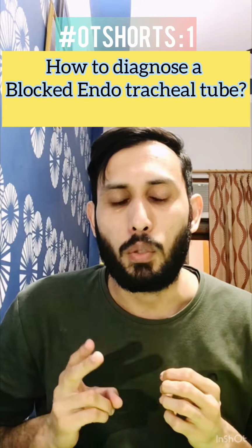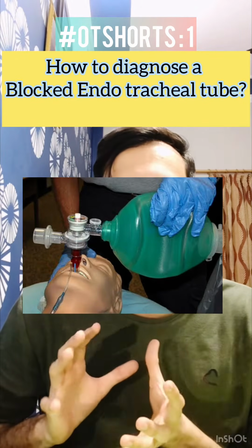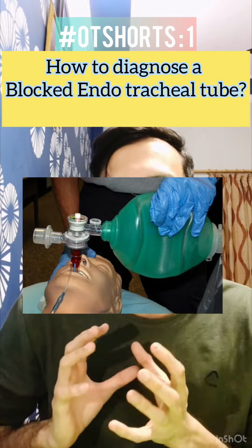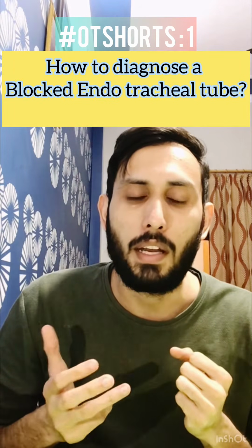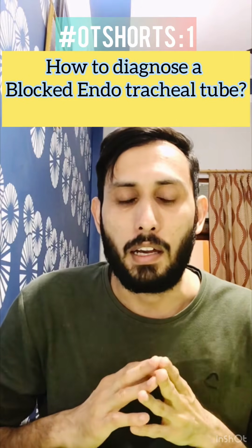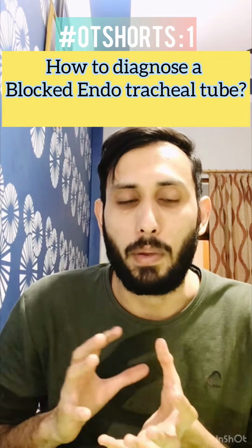The second thing that you should make a habit of is to detach the ventilator, attach an ambu bag and press the ambu bag. This first baseline compliance of the ambu bag will help you later diagnose how much the tube might have got blocked. If it is completely blocked, you won't be able to press the ambu bag at all.